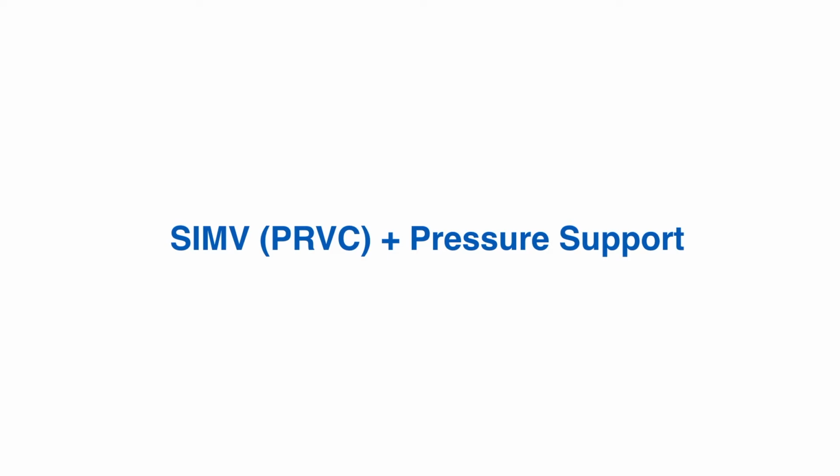Likewise, if we look at the second circumstance I described where the lung compliance improves quickly, what you'll notice is that the peak pressures will go down with time, but ventilation stays the same. So initially the patient who had the stiff lungs, who was needing 25 of the peak pressure, what you'll notice is that number will go down, so they might now go down to 20 and down to 17.